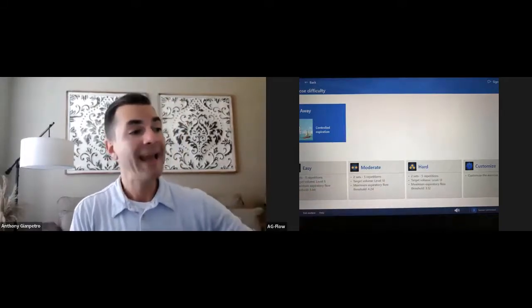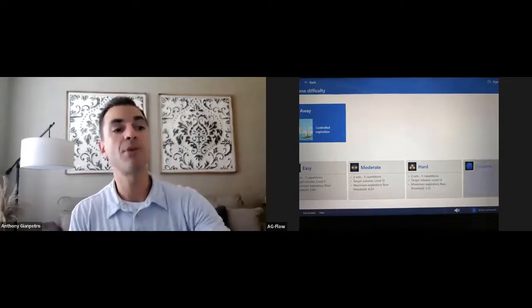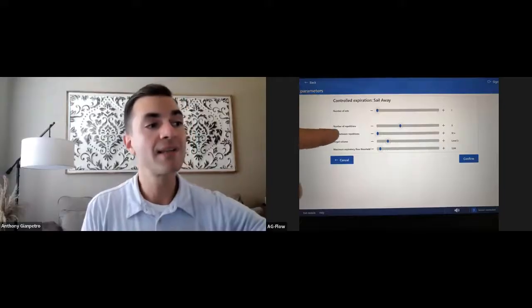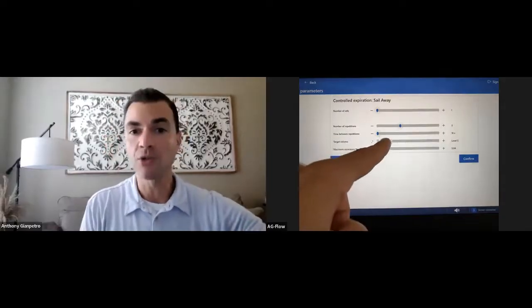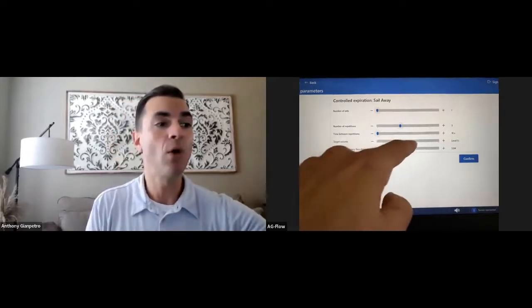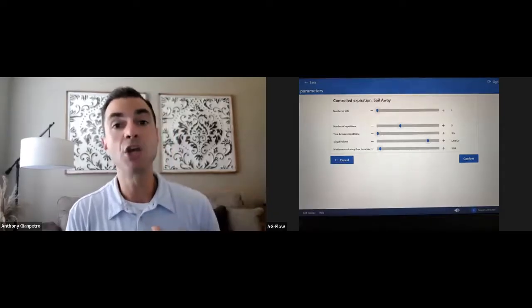That's a big one. And then all of this expiratory flow stuff, we're going to talk about in the customized parameters section. So notice that sets, reps, time between reps, I believe that would be kind of self-explanatory for you at this point. Much like the volume too, right? So again, if you think about my lungs, volume 5 is not a high enough volume. I'm going to need to move that over to something more like 10, 20, 21 to be a good challenge for me.